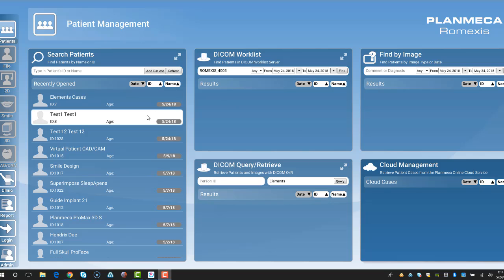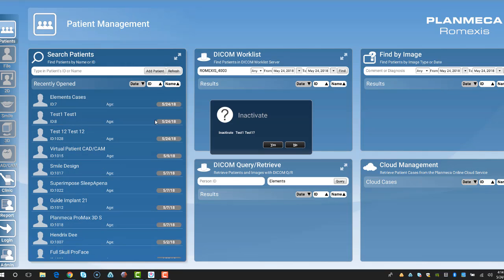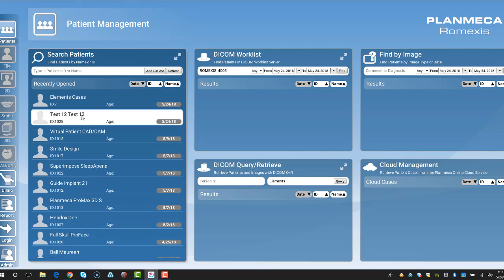First, we're going to inactivate our patient by hovering over and right-clicking. Once we right-click, we're going to hit inactivate. Then it's going to ask us for sure. We're going to hit yes, and once we hit yes, it actually inactivates our patient.